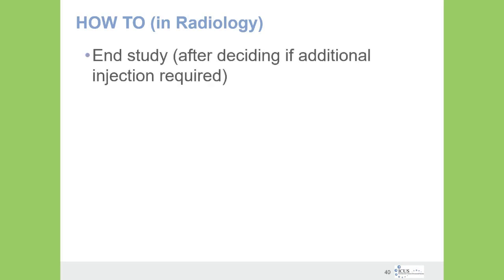If we need to, we can do another injection right at that time. And when we don't need another injection, we're going to end the study.